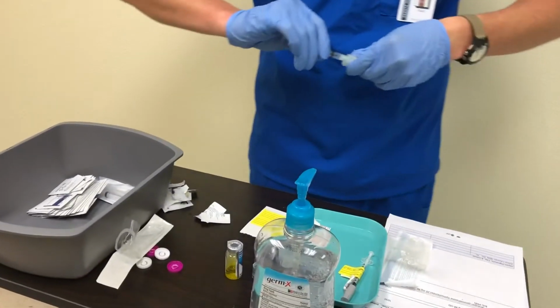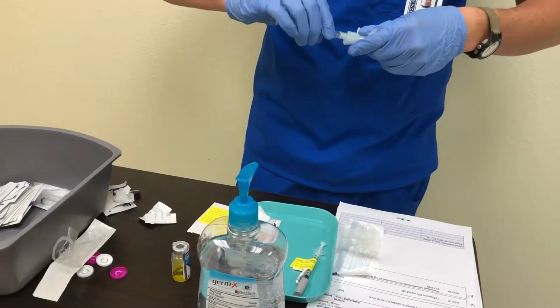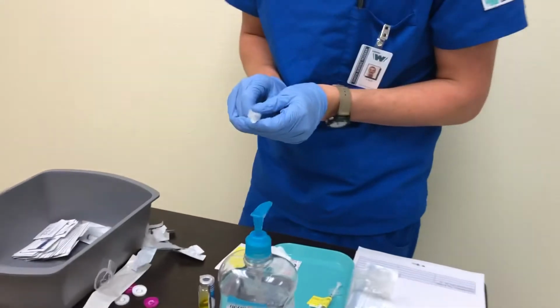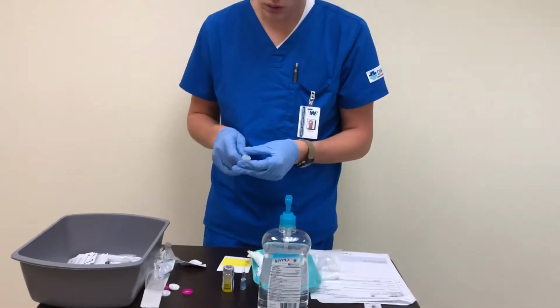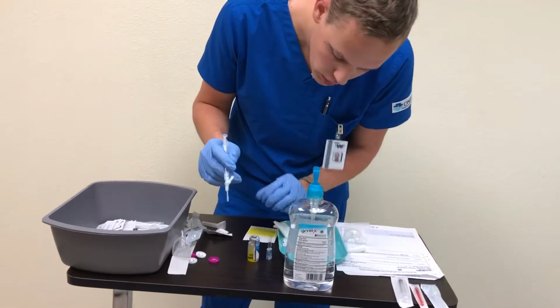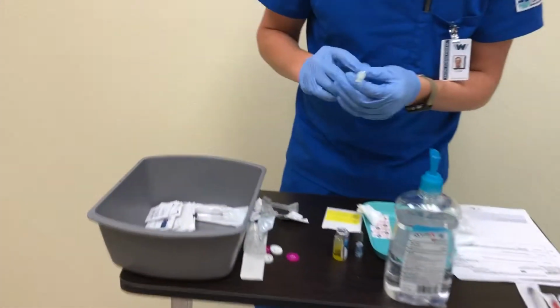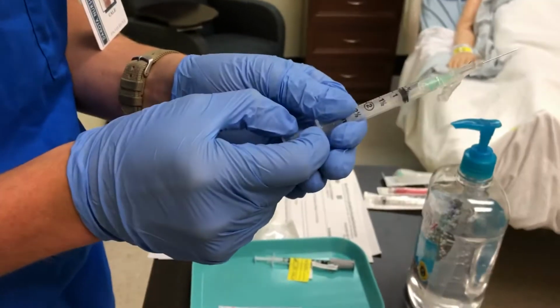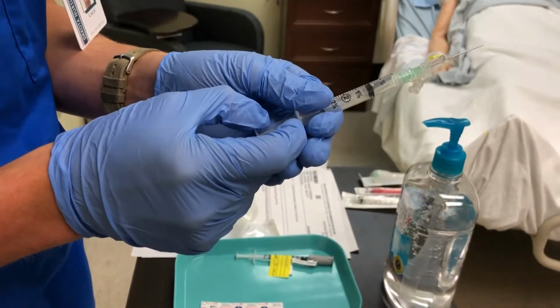And then this medication, we're not going to be administering in the skills video. This is just to show how to withdraw. And so I'm going to be pulling out 1 mil of medication from the vial.